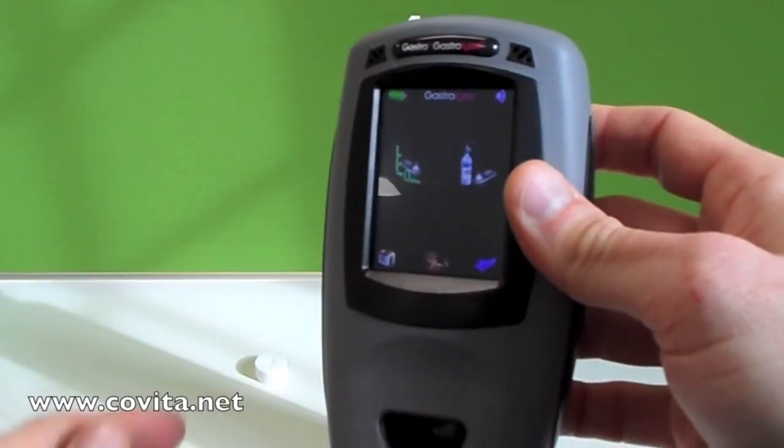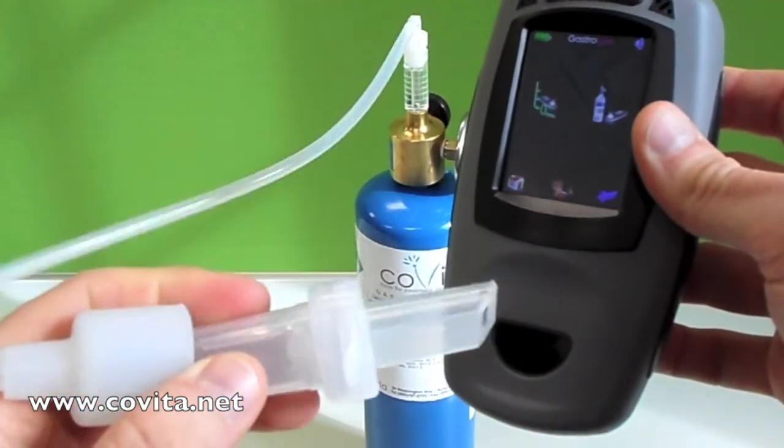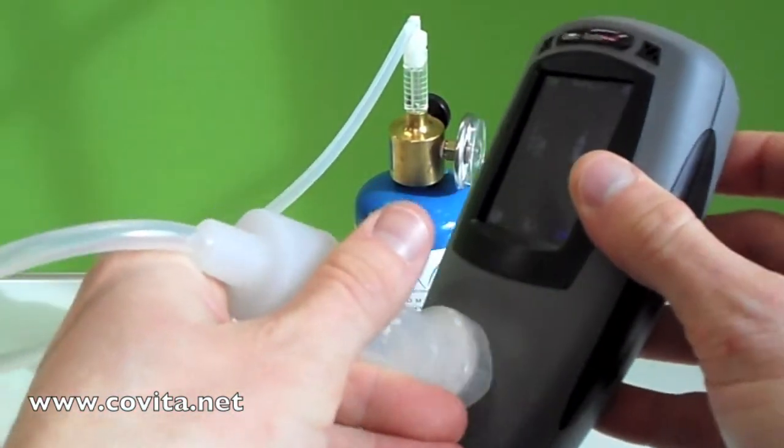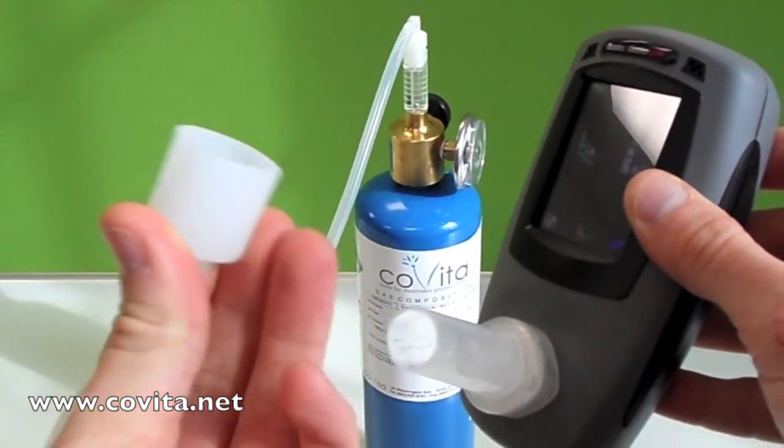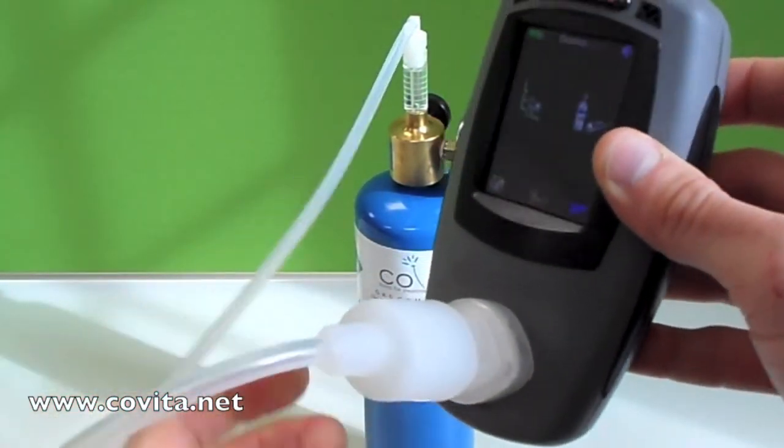Now it is time to place the D-piece into the Gastro Plus. This can only fit in one way — if it doesn't fit the first time, simply try it a different way. Now place the large end of the cali-adapter onto the D-piece.